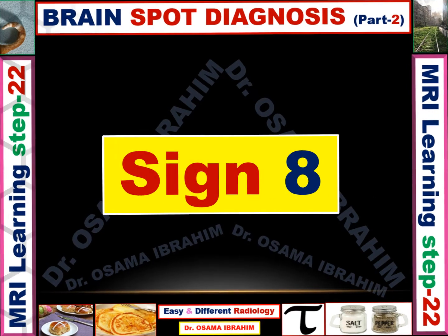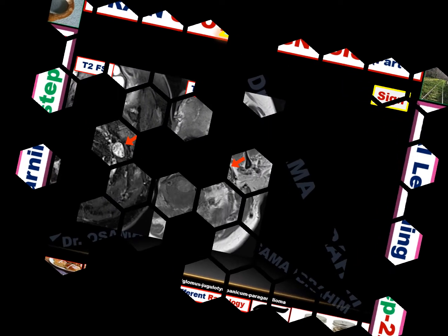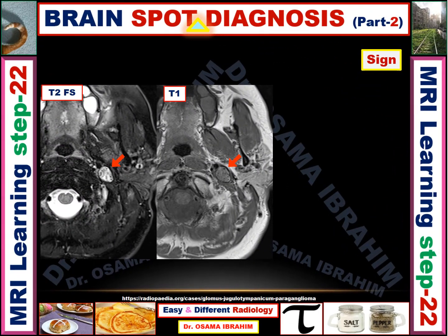And now sign 8. This is T1, as the subcutaneous fat appears bright and the CSF in the spinal canal appears dark. However, this is T2 because the CSF appears bright in the spinal canal and the subcutaneous fat is suppressed — so this is T2 with fat suppression. What is the name of the sign for this lesion?